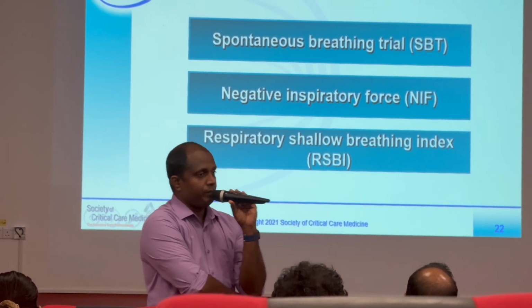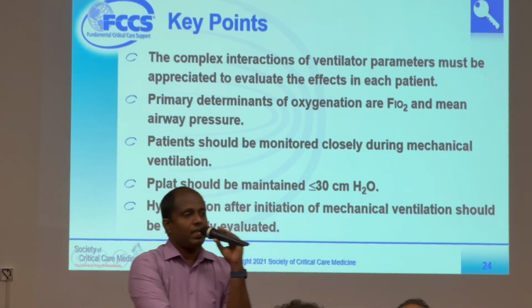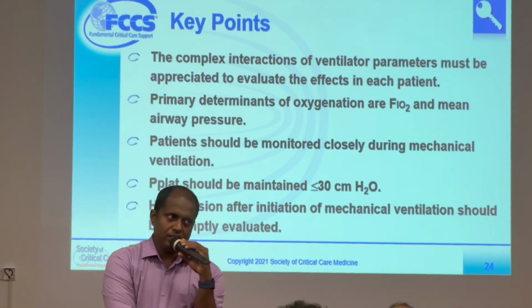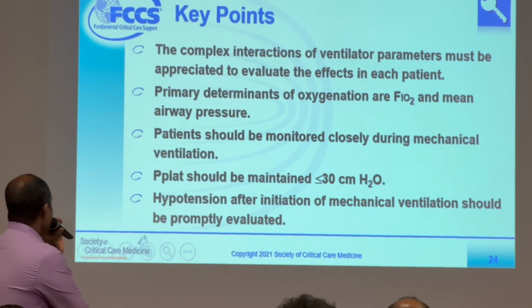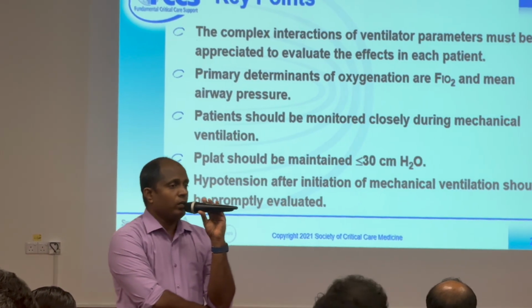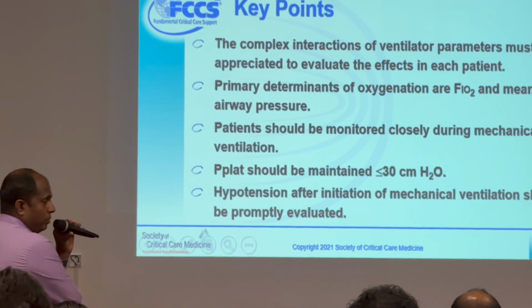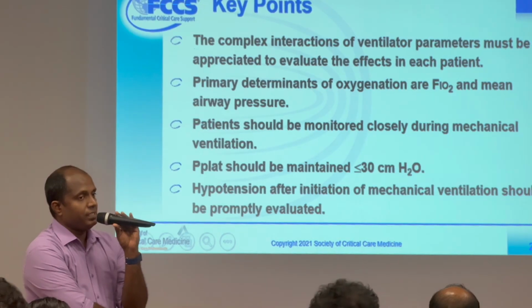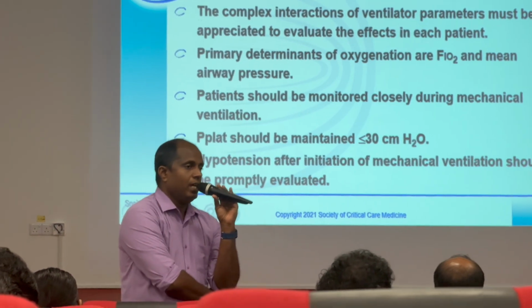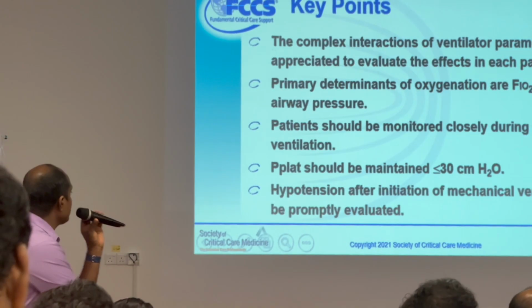So, summary. The ventilator parameters are actually integrated, as you studied in the first lectures. Oxygenation depends on FiO2 and mean airway pressure, those two. Mean airway pressure depends on three things: tidal volume, inspiratory time, and the PEEP. Okay?